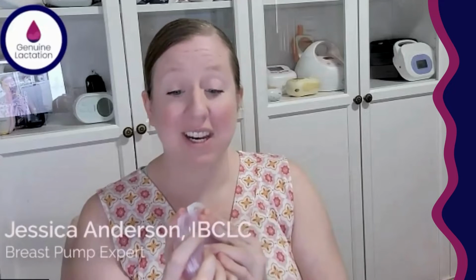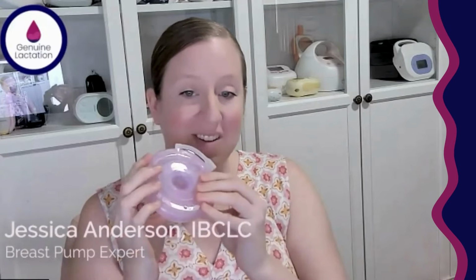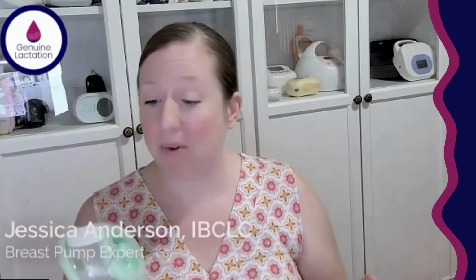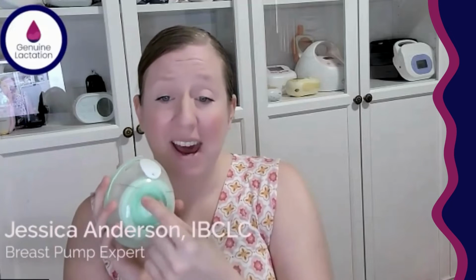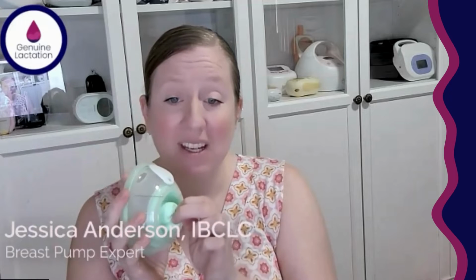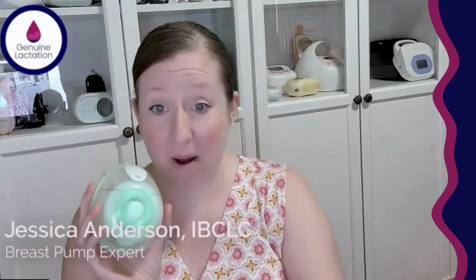Like this is a Freemie Slim cup where there is plastic that's actually snapping together, which is creating a different type of seal. So when this goes together, you can actually assure that it is connected. Let me snap this in place. You actually hear that snap. On this, it can be pretty easy to not assemble correctly. And the dangerous part of that is if this is not assembled correctly or this gets warped, this membrane is the part that is keeping the milk out of your pump.